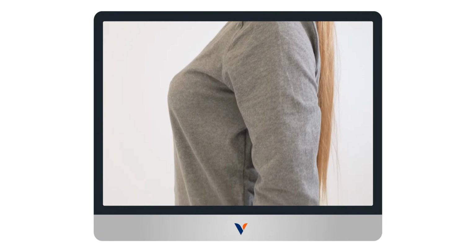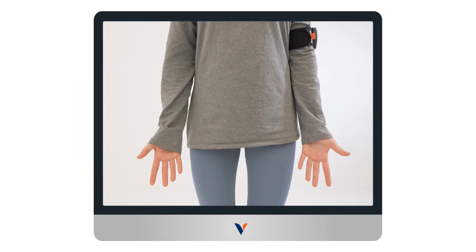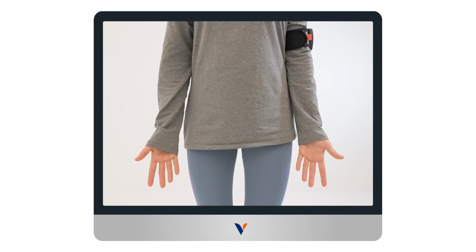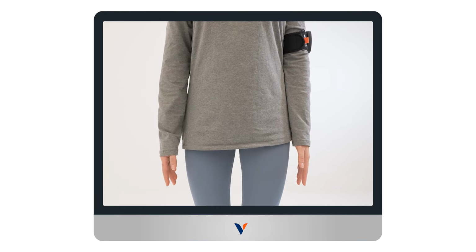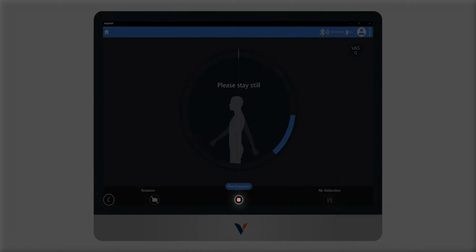Starting from the orthostatic position, with the arms at the side and the elbow extended, the subject rotates the arm upward, bringing the palm towards the body. Then, have the subject return to the neutral position and rotate the arm backwards behind the body. Once the patient is ready, start the acquisition by clicking on Rec.